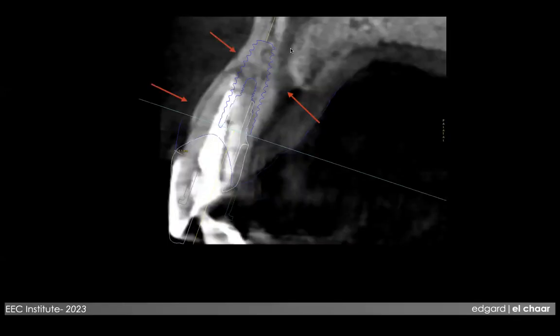Now, this is not the only challenge that I'm looking for. So as I'm circling back at 1.1, I want you to see the other challenges. And a lot of clinicians are missing this point. You have a nasopalatine. That's a bundle of nerve and vessel of no consequence that comes out of the bone between the two centrals. I'm explaining this also for the non-clinicians, for the public, and that's important for them to understand these things.